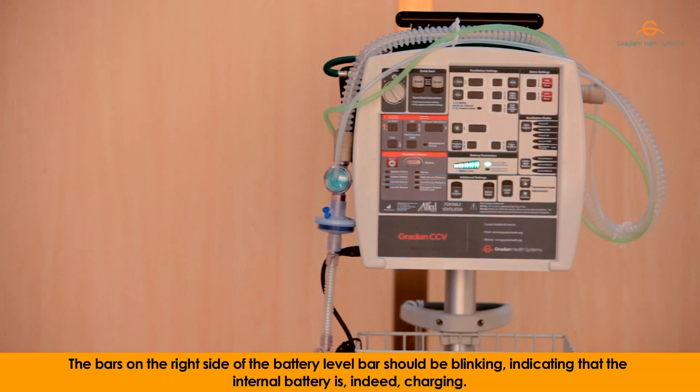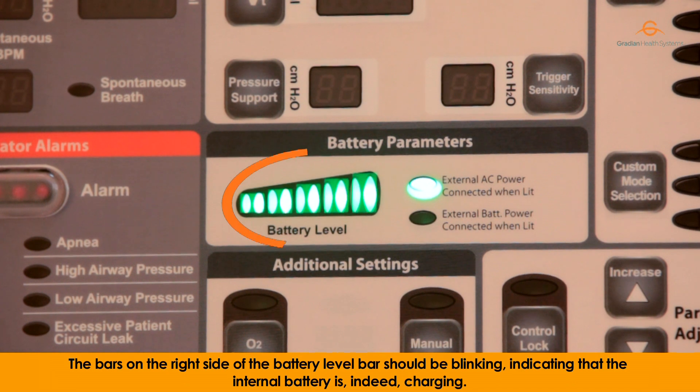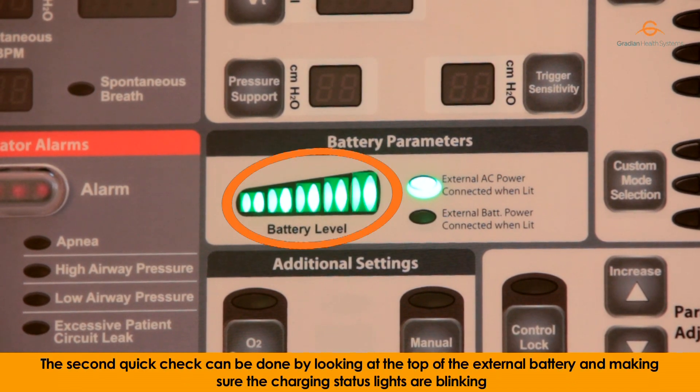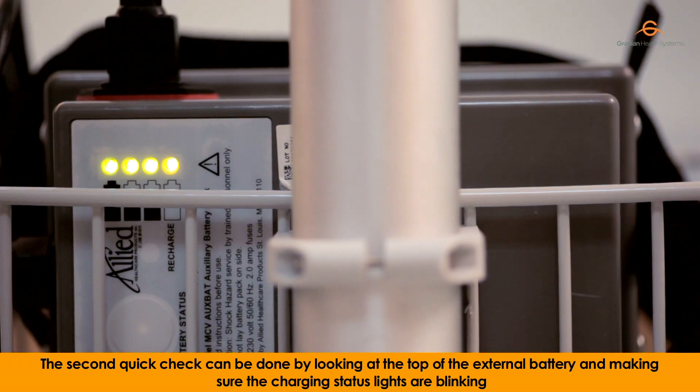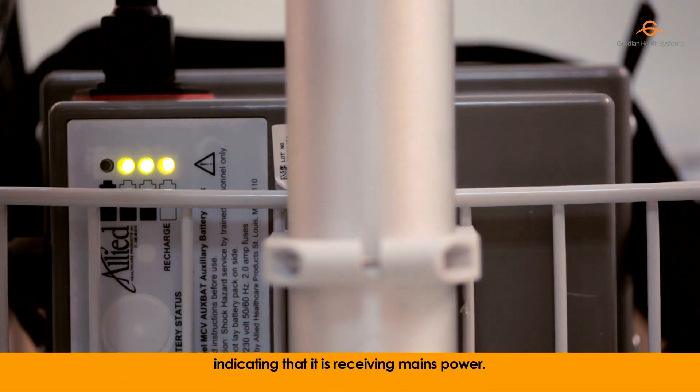The bars on the right side of the battery level bar should be blinking, indicating that the internal battery is indeed charging. The second quick check can be done by looking at the top of the external battery and making sure the charging status lights are blinking, indicating that it is receiving mains power.